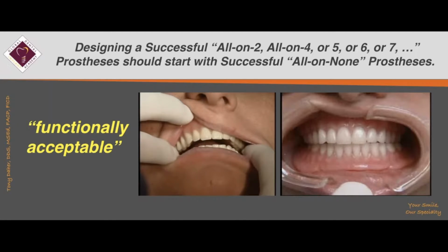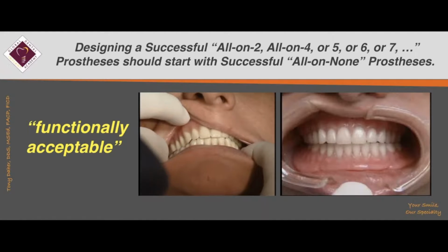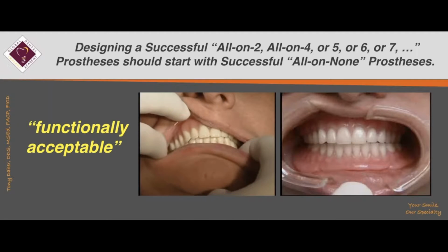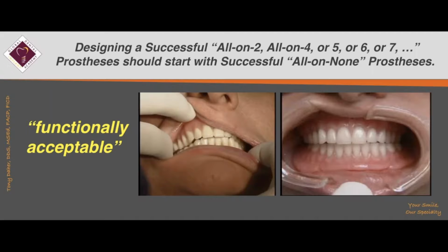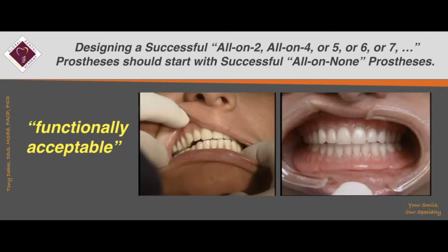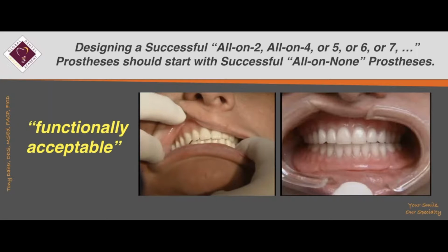Back. Right. Move forward. Back. Move forward. And you hear that sound, back, the suction is broken. Move to the side. Back. Move to the side. Back. And move to the side.